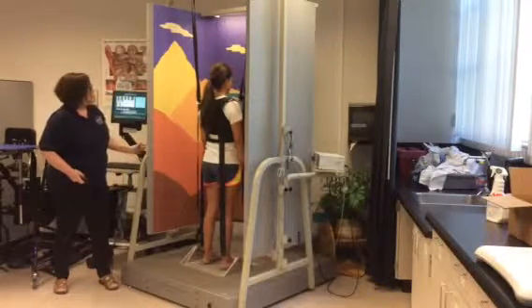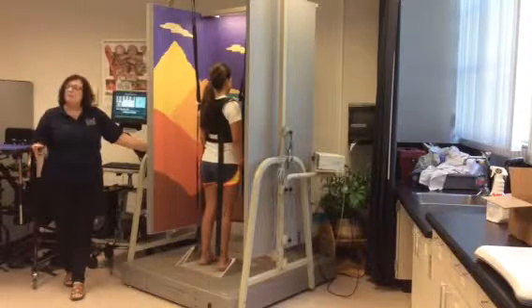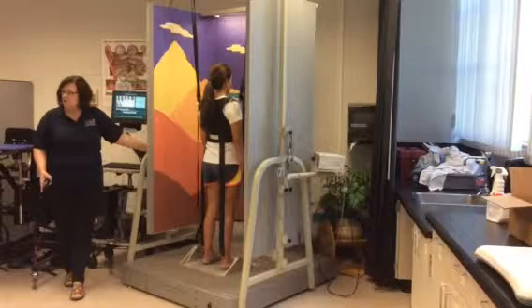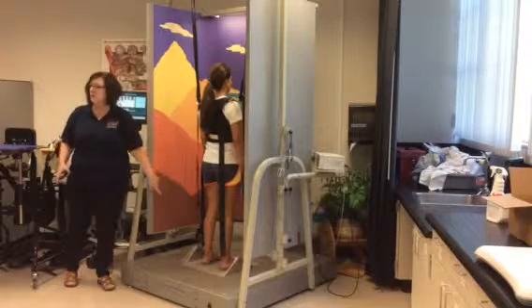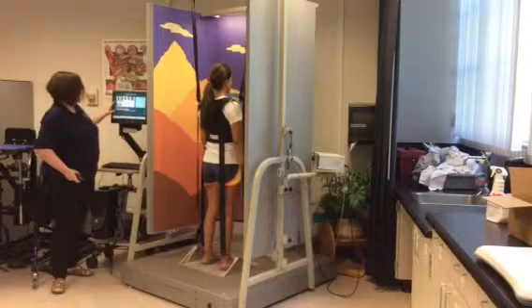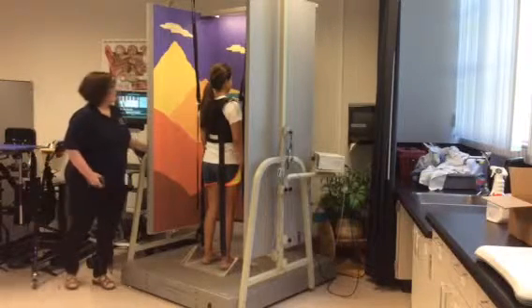Okay, watch this. So that was a small one, but this is a bigger one. So if I put in a bigger stimulus, what should the motor response look like? Bigger. And bigger and faster. If the central nervous system is intact. Meaning the stimulus is going up and generating motor output right away. And this is timing in milliseconds, and her response was about 80 milliseconds. Yeah. Okay, now watch this.